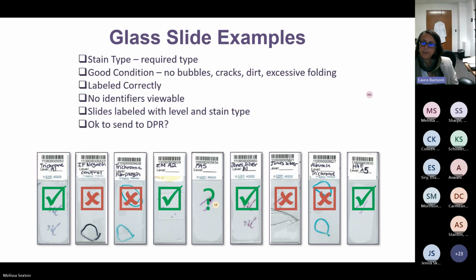So when you focus here, it's not focusing here because now your slide is tilted. So if you have 2 labels in the back, you should put 2 small labels at the bottom, one on top of the other, in a way that doesn't cover the tissue, so that your section is still flat. And now you can scan.